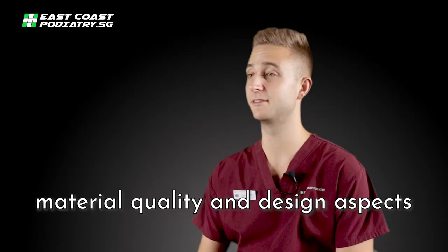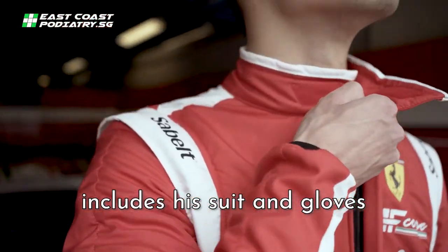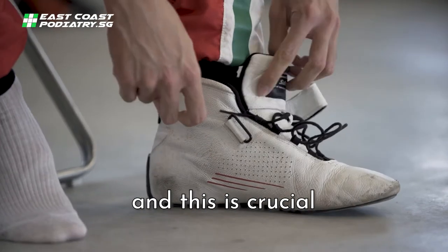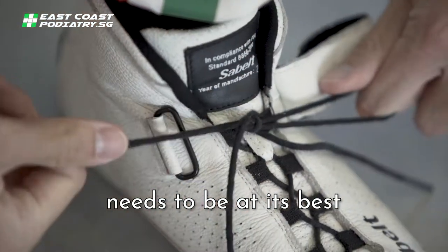We are constantly improving the material quality and the design aspects. The racing system of a driver includes a suit and gloves that need to be fireproof yet comfortable. However, this is still incomplete without the ideal foot gear. And this is crucial, because the driver's shoes and their internal orthotic system need to be at their best.